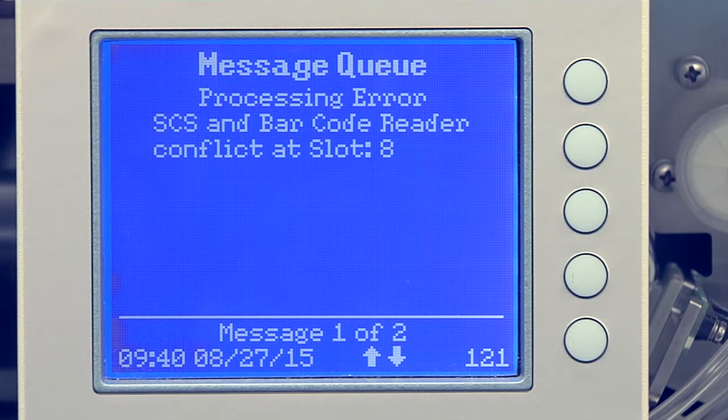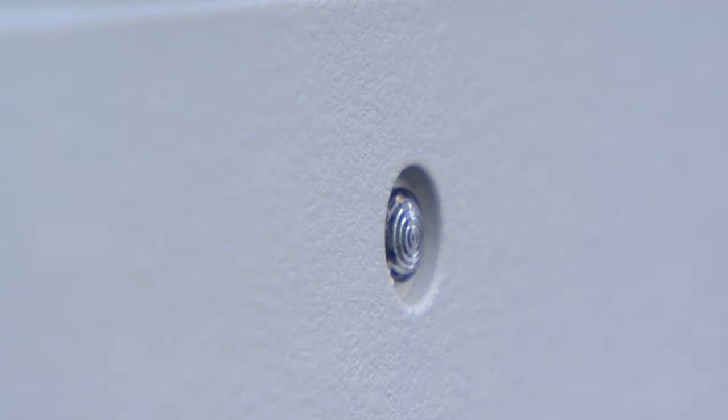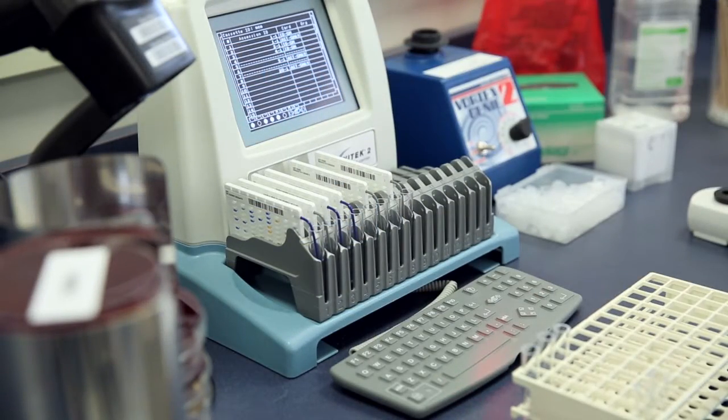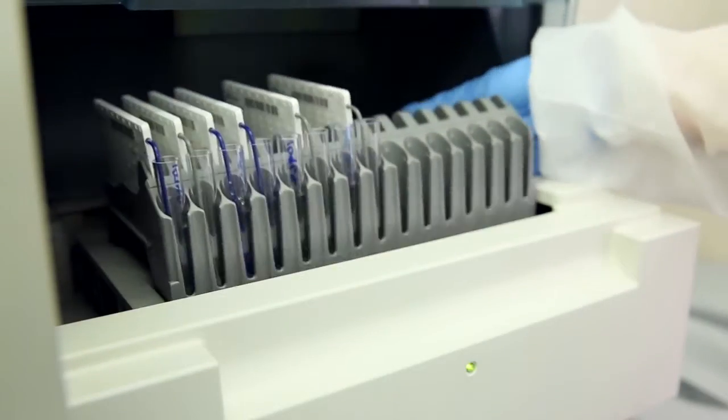Returning the cassette to the Smart Carrier Station may be helpful in determining the discrepancy. A green blinking light below the Load Unload door indicates it is okay to remove the cassette from the instrument. At the Data Entry screen of the Smart Carrier Station, locate the slot with the error and determine which information did not agree and make the necessary corrections. Once all issues are resolved, place the cassette back on the instrument.